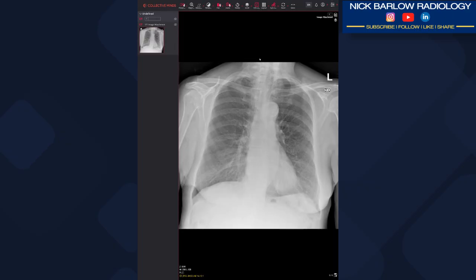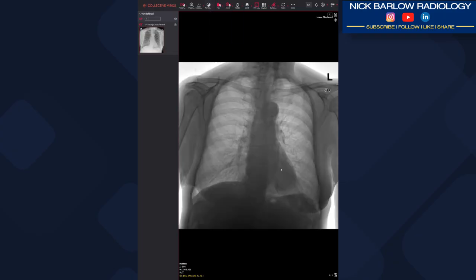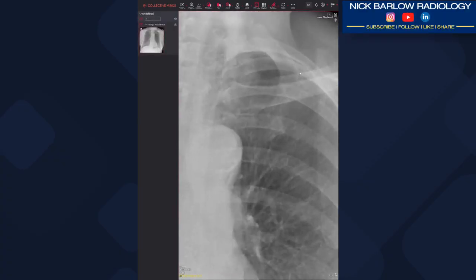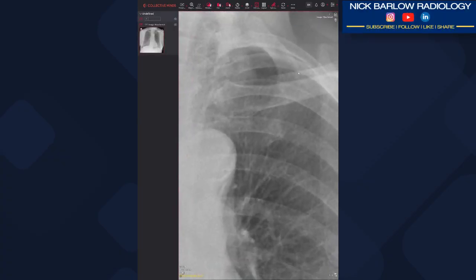Initial assessment looks okay. We can invert the image just to look behind the heart, under the hemidiaphragms and at the apices. On closer inspection we do have this area of opacity here projected over the anterior left first rib and posterior left fifth rib.